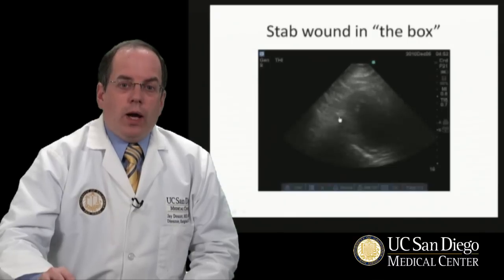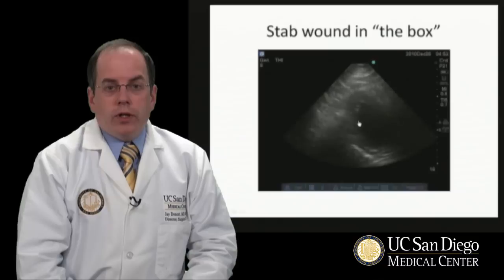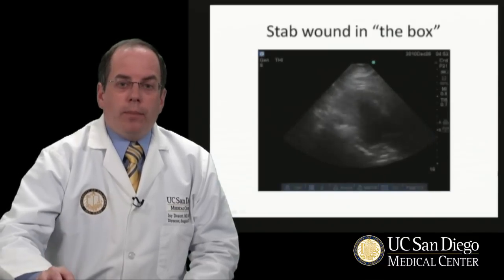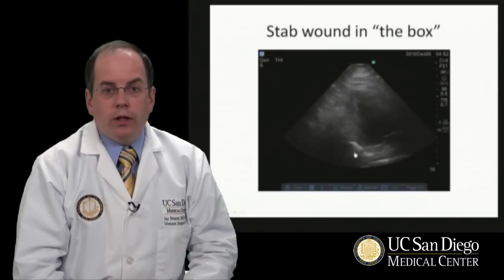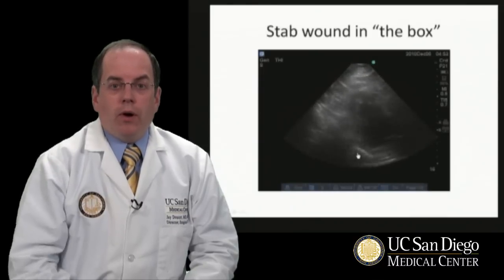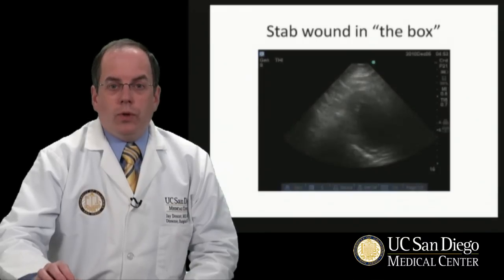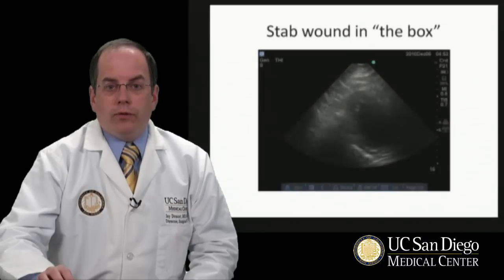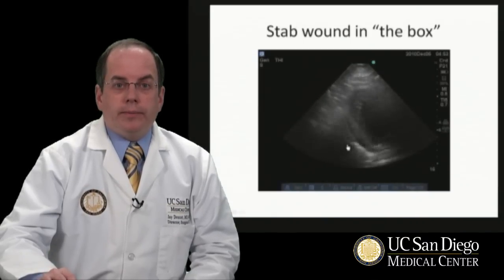Here's a patient who has a stab wound in the box. Although the amount of fluid here is small, it can be picked up. If you look posteriorly here, which is often the place that fluid is first seen, you'll see that occasionally a black line appears between the layers of the pericardium and the heart. This is typical of a patient who has pericardial effusion and may be having the onset of pericardial tamponade.